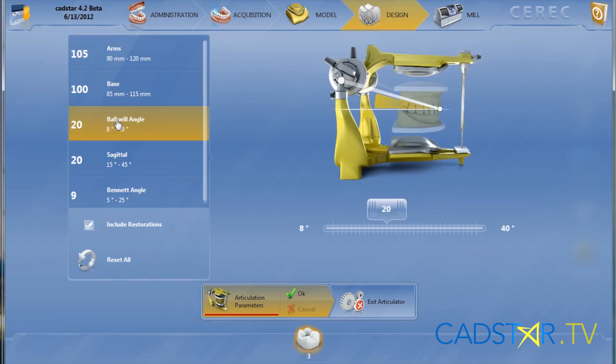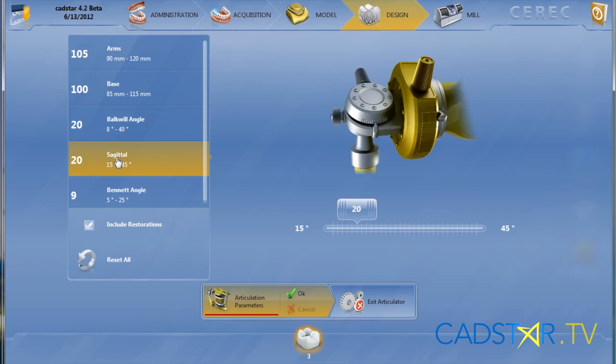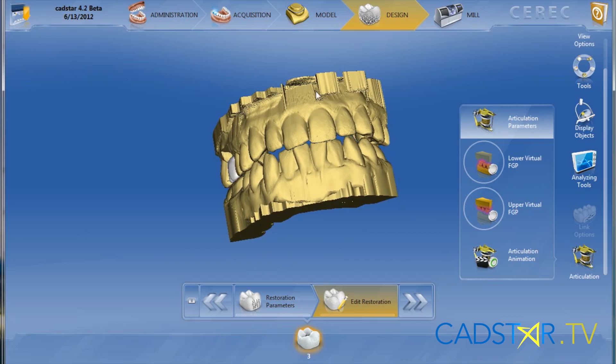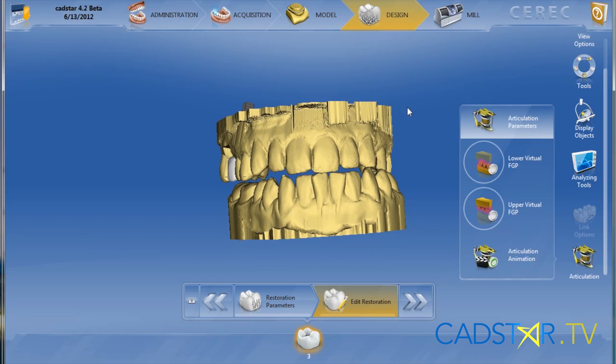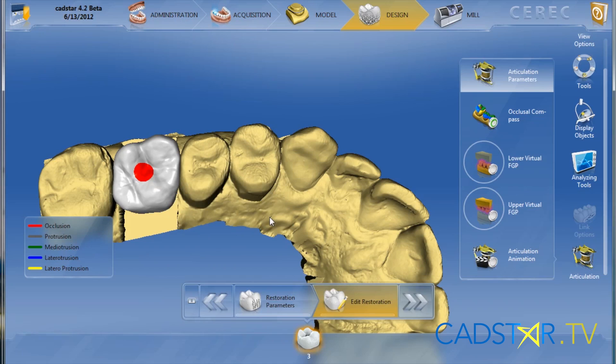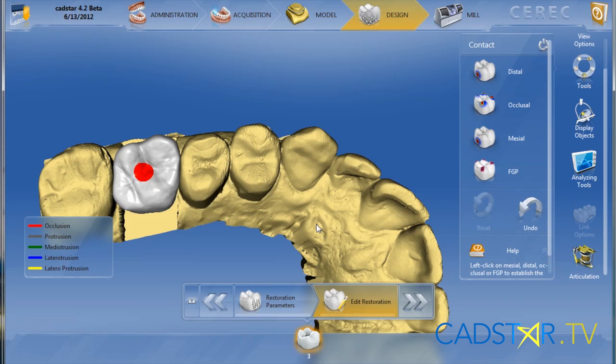We have dynamic articulation. Sirona has done a good job on this. We have a virtual articulator where we can place in the metrics and the parameters of the function for that patient, and it will be represented in a dynamic excursion activity within the virtual articulator. Within the articulating system we have a tool asset with our virtual grind that will remove the articulated lateral interferences. It's very, very accurate.